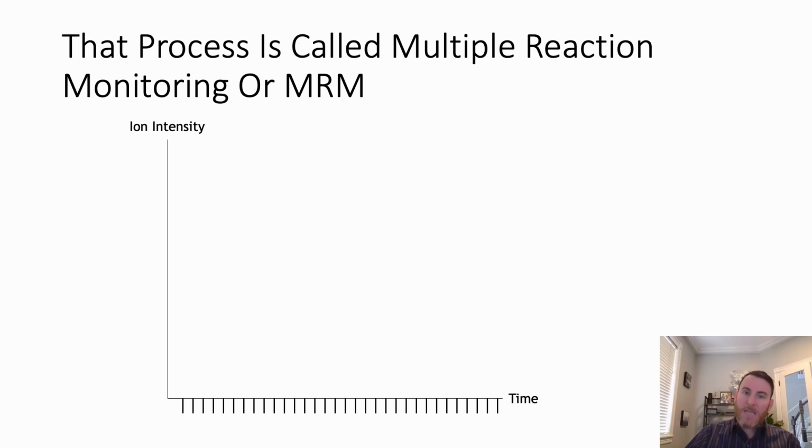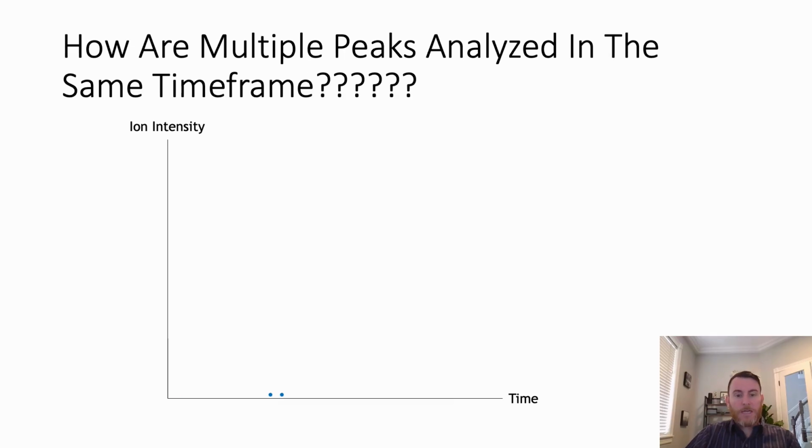And so I'm taking this exact same picture that we showed before, but now I have added colors to functionally denote the differences between each one of these. So now instead of looking for the same transition over and over again for each one of the time frames, you are creating a pattern where you're looking at three transitions and then you're starting over. And so functionally, this might look something like this.